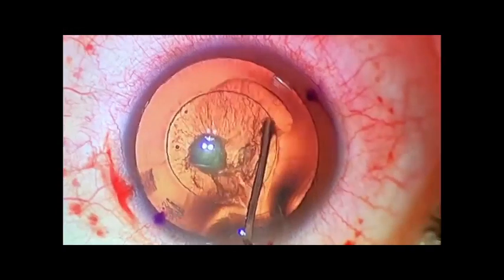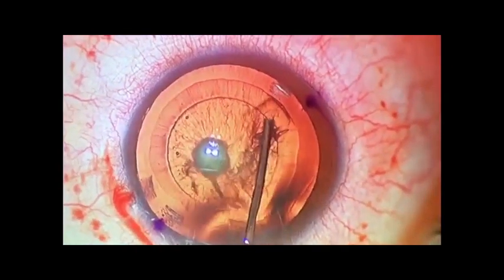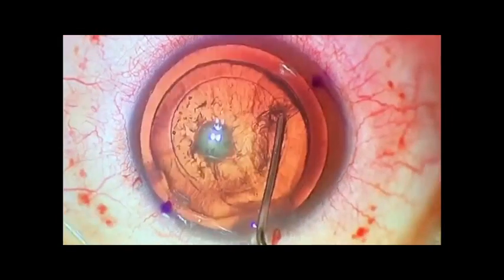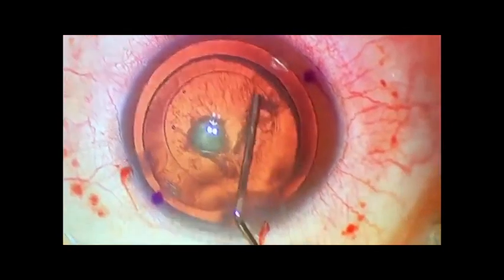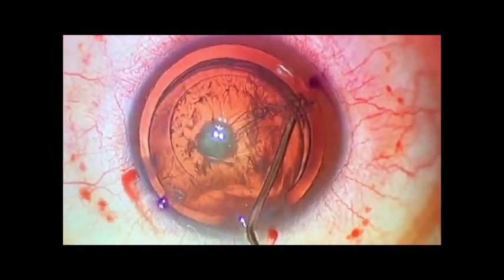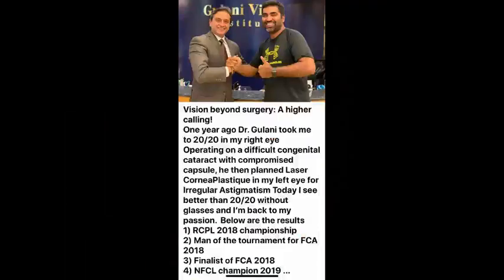In this case of congenital posterior polar cataract, I'll be showing my signature layered delineation technique, where I go in a very determined yet gentle and safe pattern of delineating with BSS deeper and deeper in layers, until I lift off the entire cataract from the posterior capsule safely. This allows me the confidence to even put in a toric premium lens implant to achieve 20/20 vision.